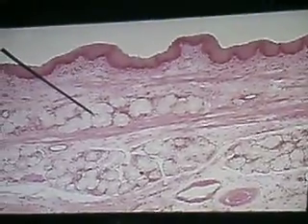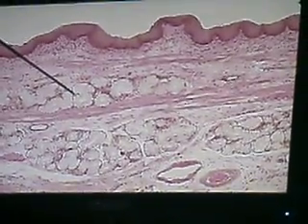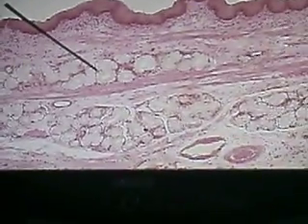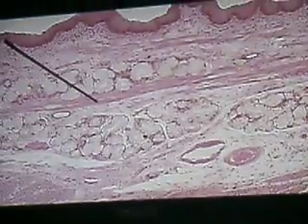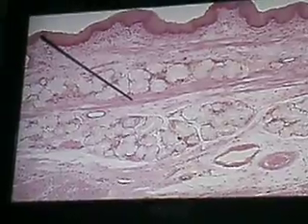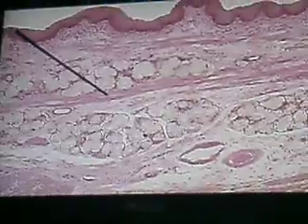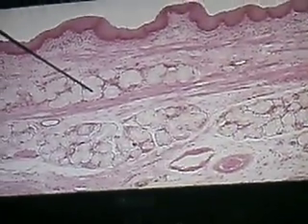If it is still in the mucosa, you refer to them as the superficial esophageal glands. Why did I say that it is still in the mucosa? Because there is a division between the mucosa and the submucosa, and the division will be the muscularis mucosa. If I say identify, then esophageal glands. Being specific, superficial esophageal glands.